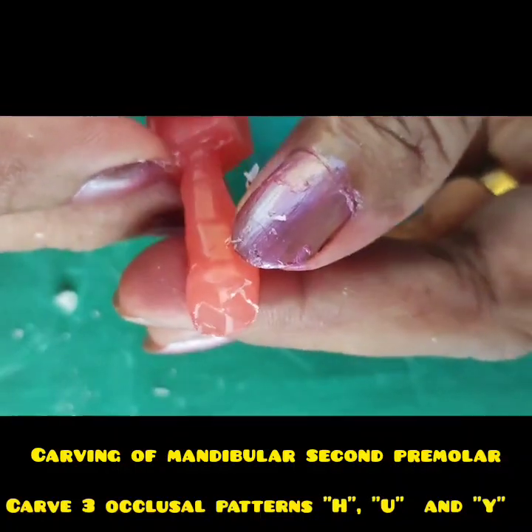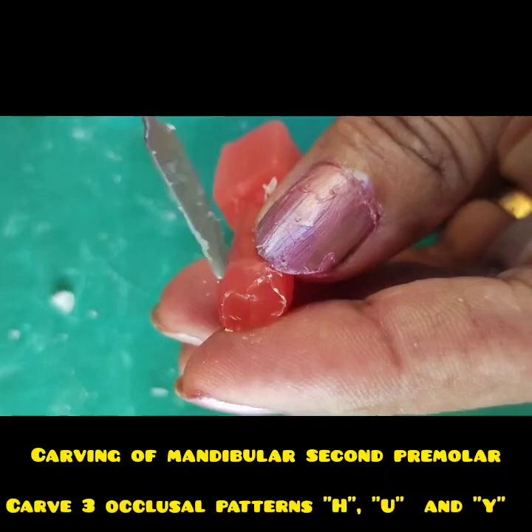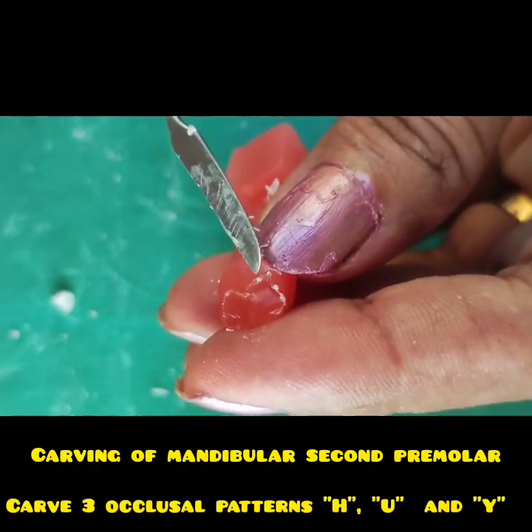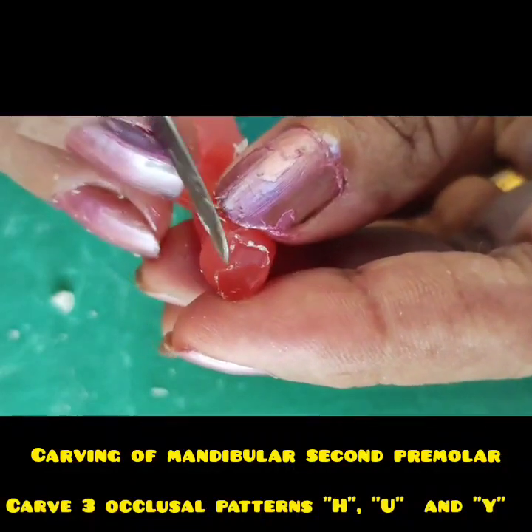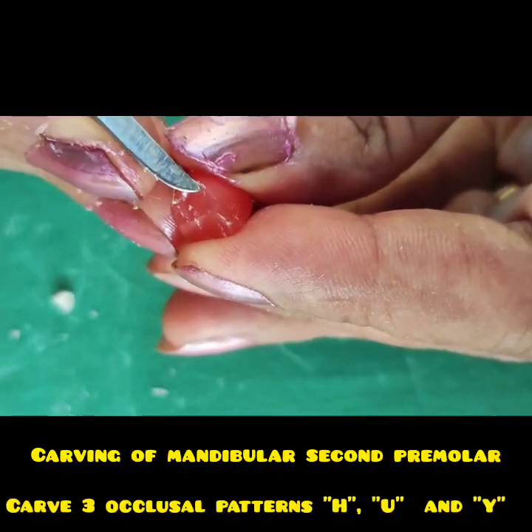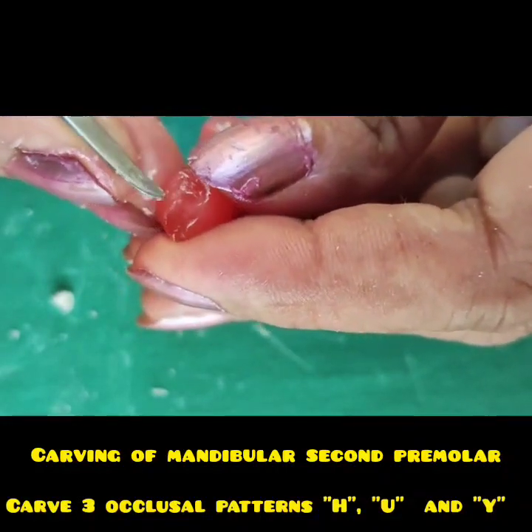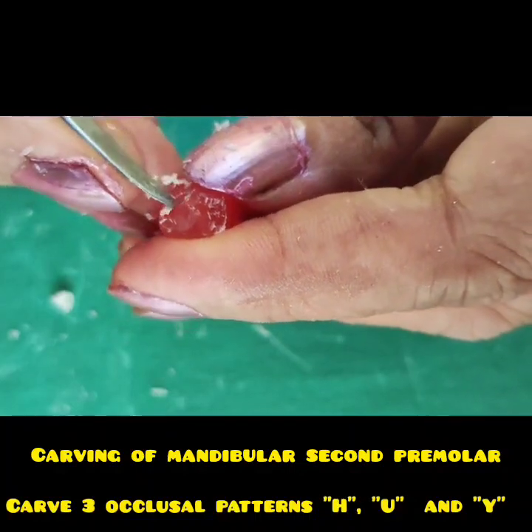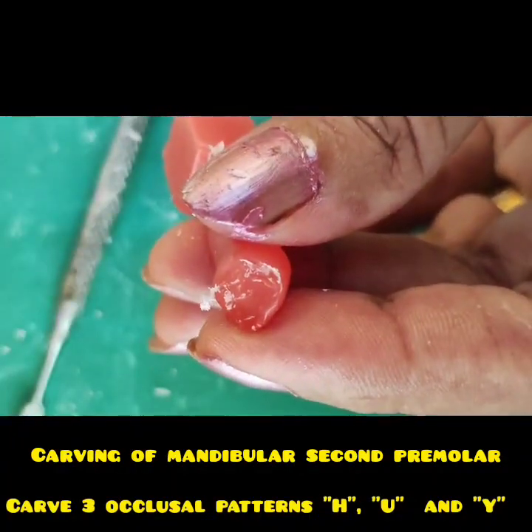Buccal cusp I have carved, and now do not make this lingual extension. Just move your carver along this step and keep your cutting edge on the lingual side, okay? So this is how, if you just remove the step. In the process of removing steps, central groove, marginal groove, your occlusal surface will get converted into U shape.